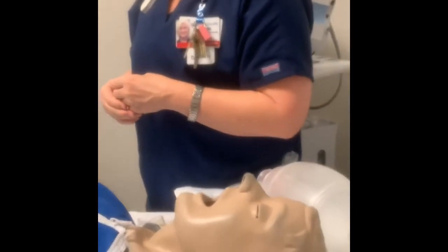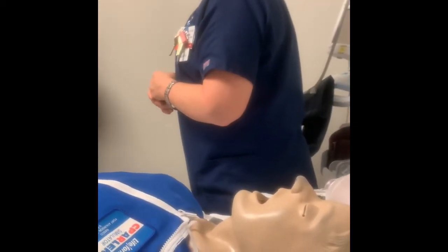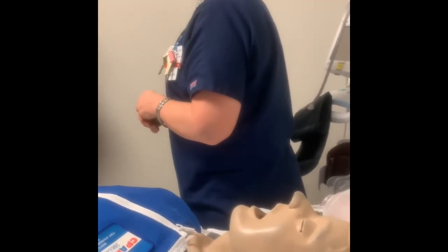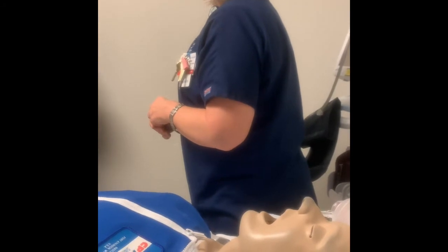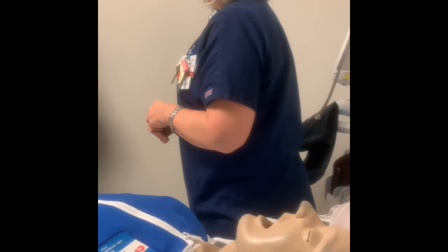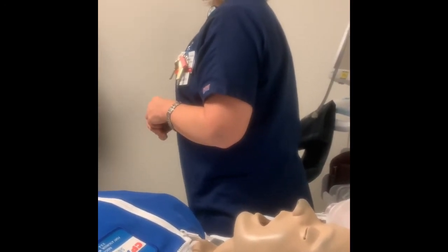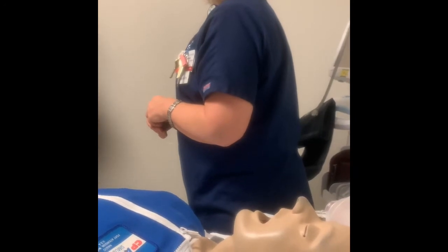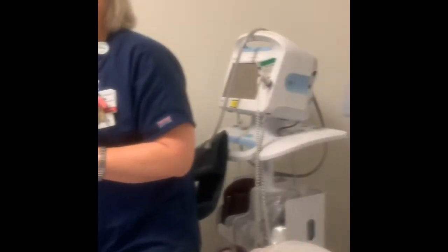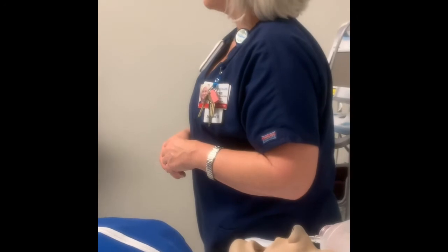What brought this to our attention is we do have a guy whose tongue is out. It almost covers his face, and he constantly, yeah, it's a very sad, terrible case. And when he goes to lay on the table, he panics because he needs to be suctioned. We attempted to suction here, but there's really nothing. It's still here. So we gave him the Yankauer, but the Yankauer is pretty big, and he kind of hurt himself a little bit trying to get around that.